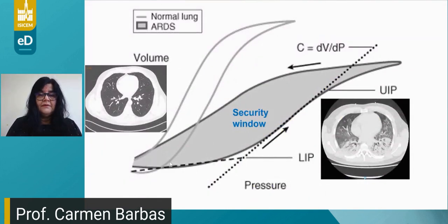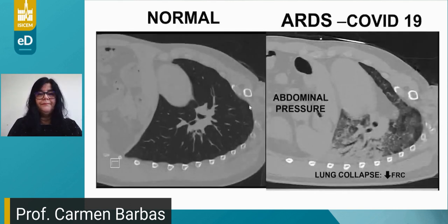It's well known in the intensive care world that when the lung is affected by ARDS, the PV curve of the respiratory system shifts to the right and down, with very low compliance sometimes in these lungs, and you can ventilate these lungs in the safety window.